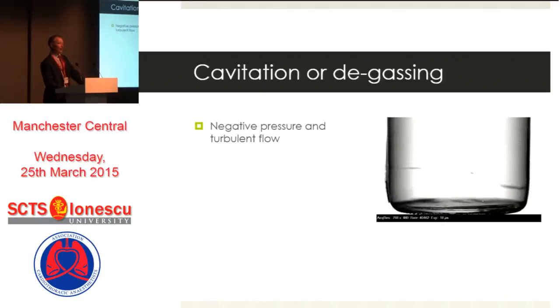This is a transient hydrodynamic phenomenon where, in the presence of a large negative pressure and sudden flow acceleration, bubbles nucleate, grow, and then collapse, all in a fraction of a millisecond. But the subsequent vortex, which you may have spotted just when those bubbles collapse, produces a considerably larger number, albeit of smaller, but more persistent bubbles.